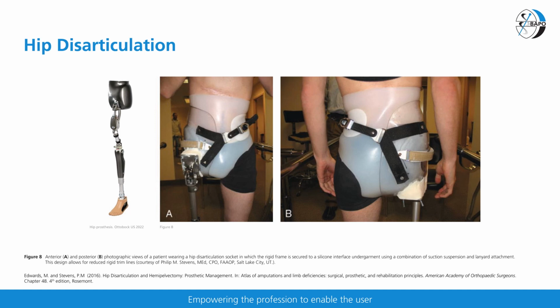They have a high rejection rate due to the increased energy requirements and weight of the potential prosthetic option, as well as the discomfort experienced, particularly in sitting with the prosthesis. As you can see in the image on the left, in terms of the cumbersome nature of these devices. However, advances in technology are improving, and the acceptance and use of these prostheses is increasing.